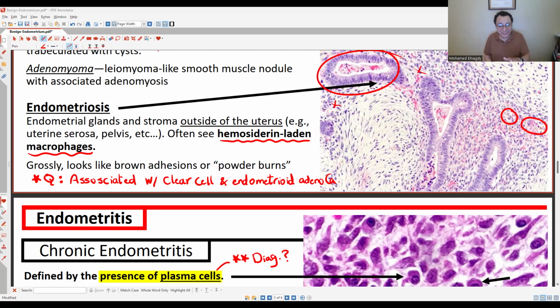That's what the attending needs to hear, you know? He's telling you, oh, I don't see enough evidence. What do you think, Abdurrahman? What do you think we need to do here? Oh, well, maybe we can do deeper levels. He will get so happy. Yeah, we do some deeper levels because the deeper levels might actually catch the endometrial glands, or you might see endometrial glands and endometrial stroma in the deeper levels. If you see in the deeper levels hemosiderin-laden macrophages and some areas of spindle cells which might be endometrial stroma, then I did what Hayek recommended.